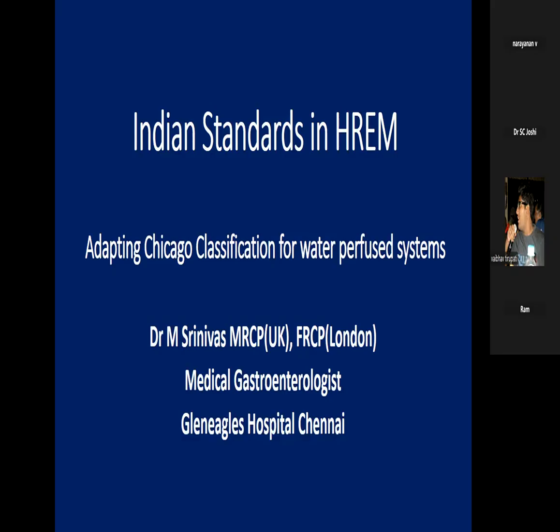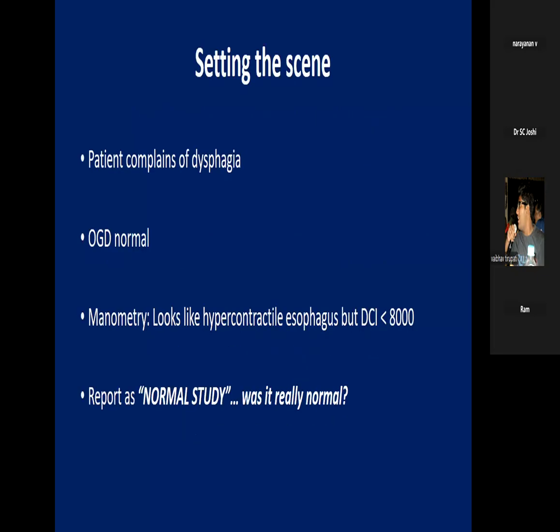Thank you, sir. Good evening, ladies and gentlemen. Thank you, Prashanth and Narayanan, for giving me this opportunity. The topic given to me was Indian standards in high resolution esophageal manometry, adapting Chicago classification for water perfused system. So, I am setting the scene for this.